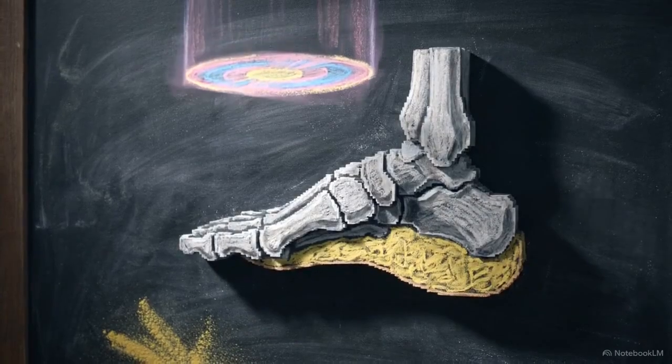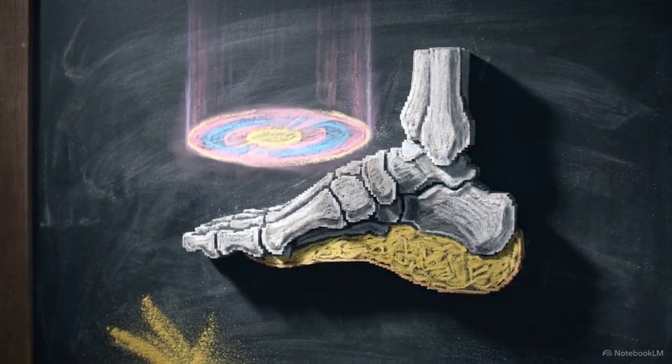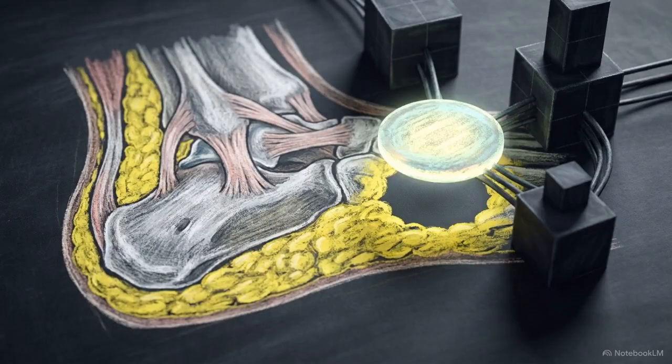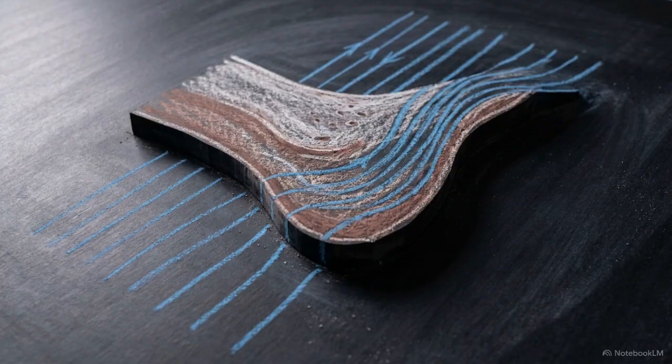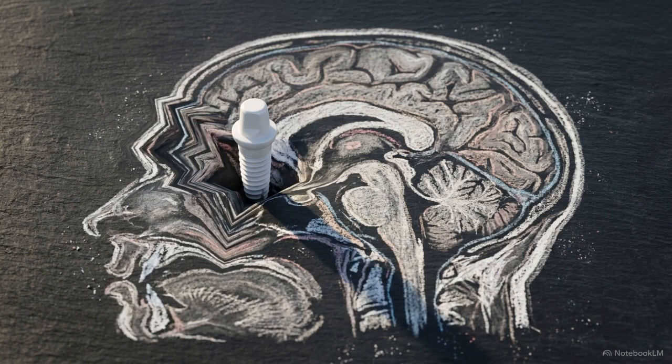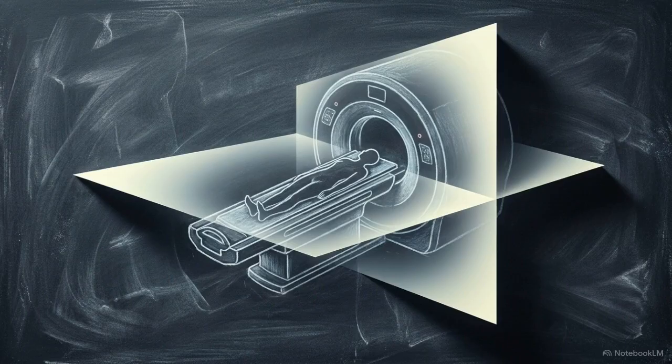This shifting frequency also compromises specific imaging protocols. Fat saturation techniques rely on a narrow radiofrequency pulse targeted exactly at the fat peak to null its signal. Rapidly changing anatomical contours, like the shape of an ankle, warp the local magnetic field just enough to shift the fat frequency outside that targeted RF pulse, causing the saturation to fail. Anytime the local field loses its homogeneity, it forces the scanner to plot technically accurate Larmor frequencies into false physical realities. Moving beyond the local field, we hit the gradient spatial encoding phase.